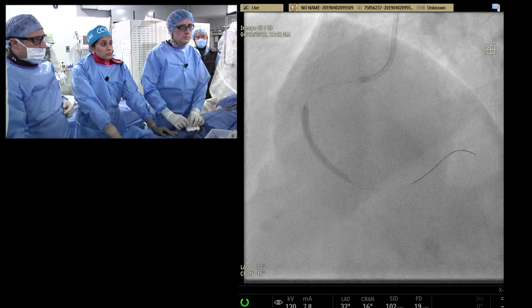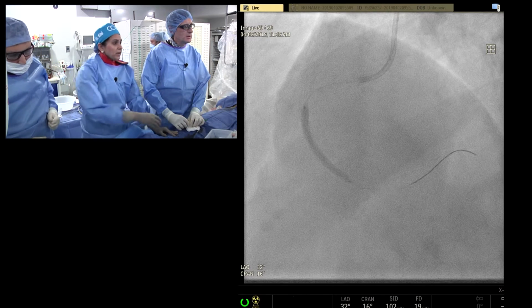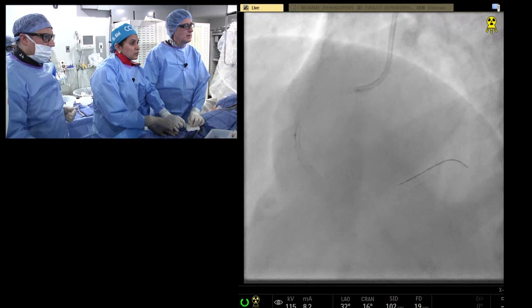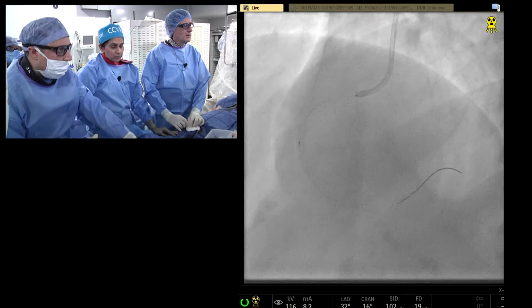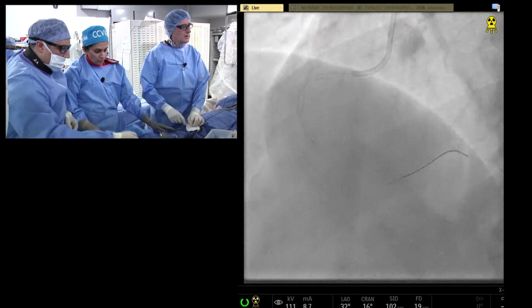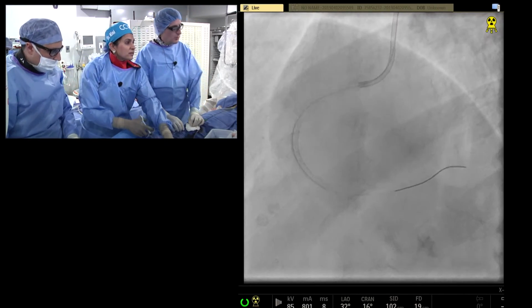Okay, so show us what you're doing. And you see here, that's where they started their imaging, all the way from here, all the way to the, this is your first stent? See, 28. 32, I'll probably go. Let's see where we are here. And you see they're using their markers to measure the stent length. 28. 3.0, 3.5. 3.0, 28. On a post-dil with 3.5.